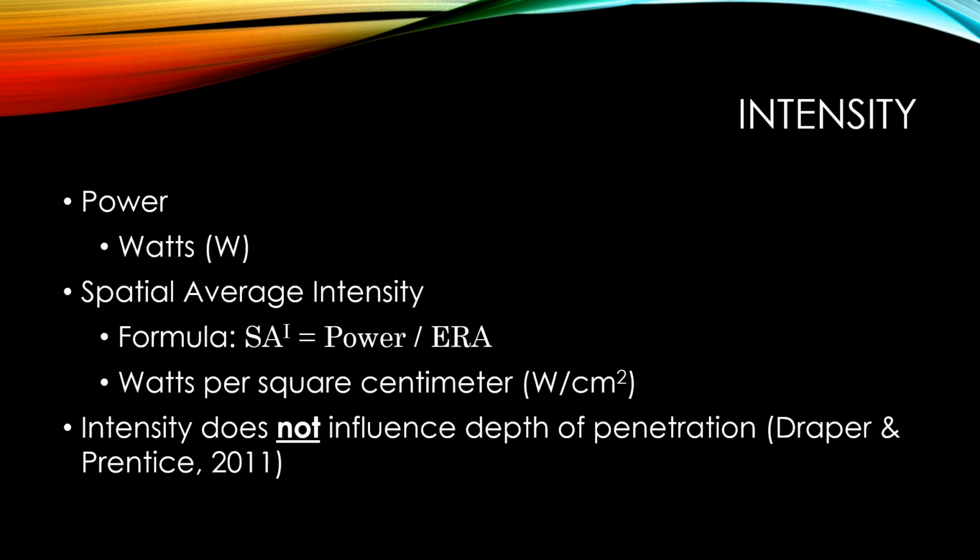Now, if it's putting out, say, 5 watts, that's going to be very different if it's putting out 5 watts in that teeny tiny little half square centimeter sound head, or if it's putting out 5 watts across a much larger, say, 5 square centimeter sound head.